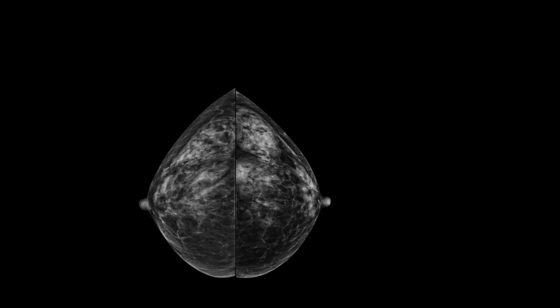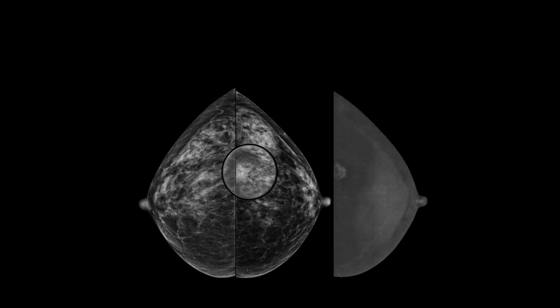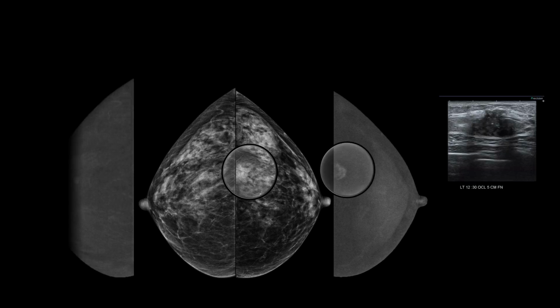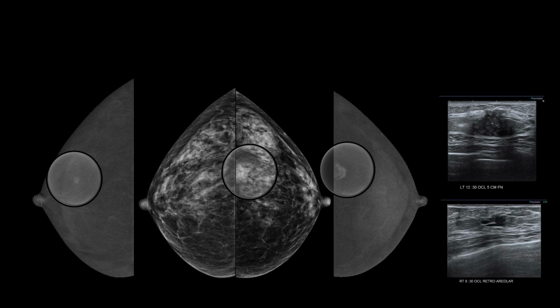Another typical scenario: the patient is being called back, abnormal screen. Everybody can see that, right? The patient has contrast enhanced mammography. We can appreciate the lesion. We can see the lesion on ultrasound. And we can see another tiny lesion. Now, it is definitely occult on the lower energy view, but on ultrasound we can find it the same day.